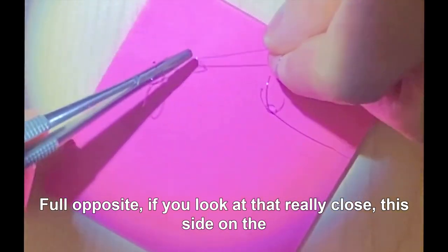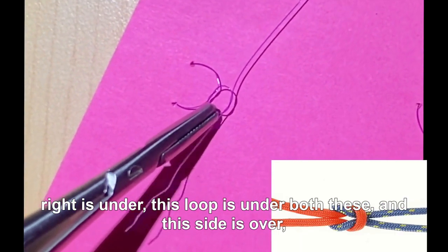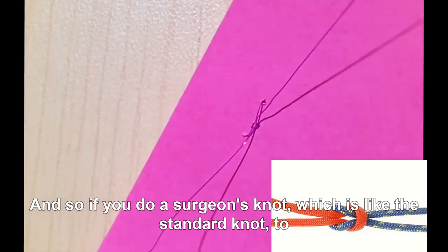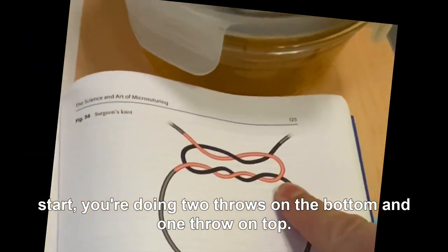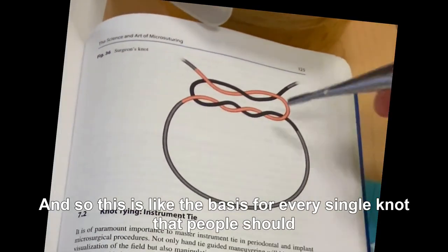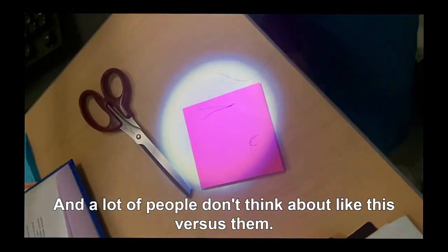Towards the tail, pull opposite — so if you look at that really close, this side on the right: this loop is under both of these, and this side is over, just like the picture. If you do a surgeon's knot, which is the standard knot to start, you're doing two throws on the bottom and one throw on top — and still you have this loop on top and this on bottom. This is the basis for every single knot, so it doesn't come loose.